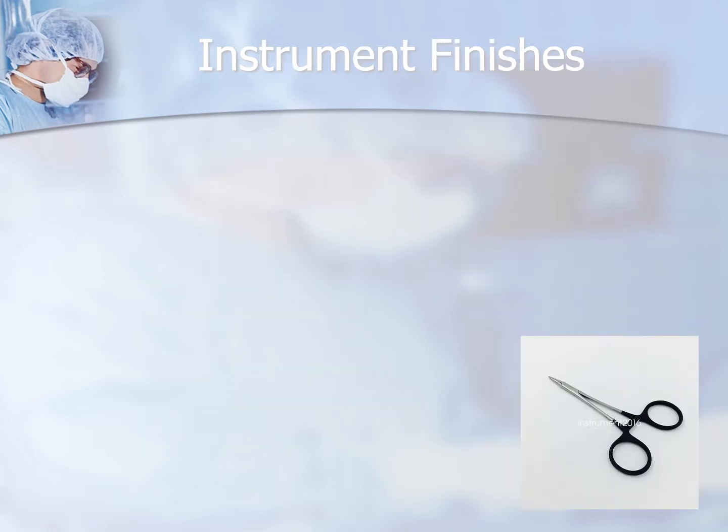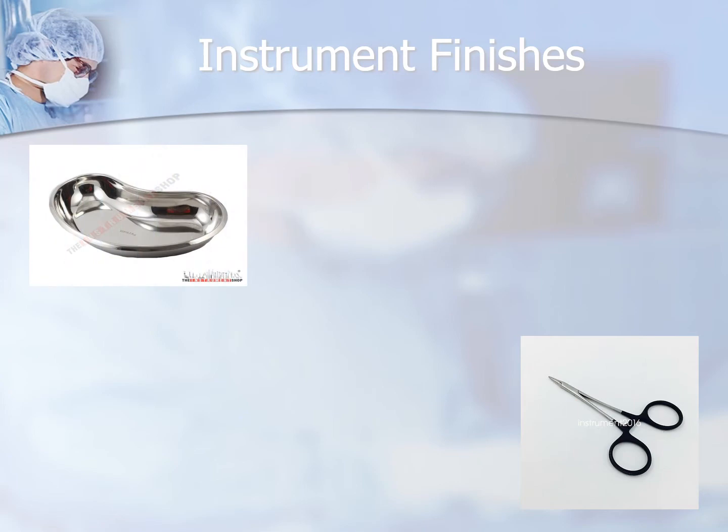So here we're going to look at some instrument finishes. Can you guess what this first one is that is showing in your bottom right hand corner of your slide? If you said the ones that have tungsten carbide inserts, you would be absolutely correct. Let's look at another one here. What about this one? What would you say this finish is? It looks pretty shiny, right? Pretty reflective. That's probably the highly polished one or mirror finished one.